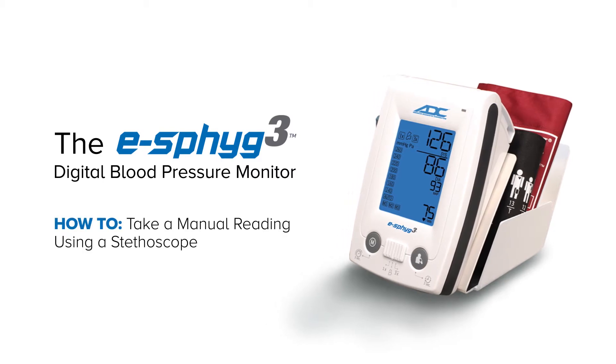In this mode, the eSFIG3 device serves only as a pressure gauge. You'll need to use a stethoscope to listen for systolic and diastolic Korotkoff sounds.